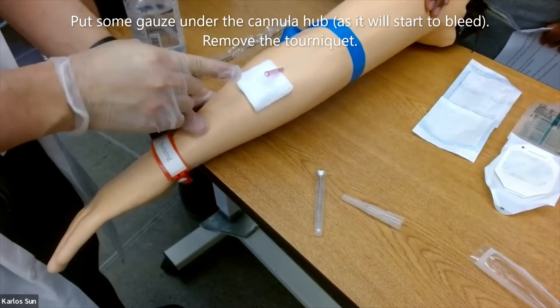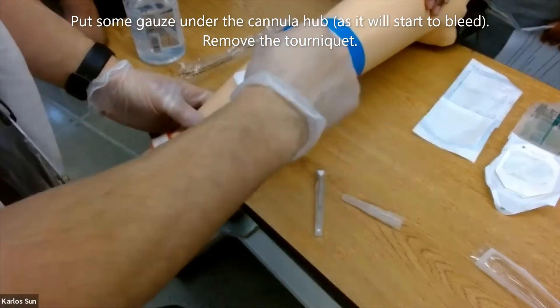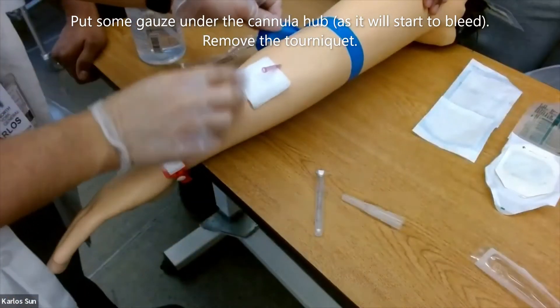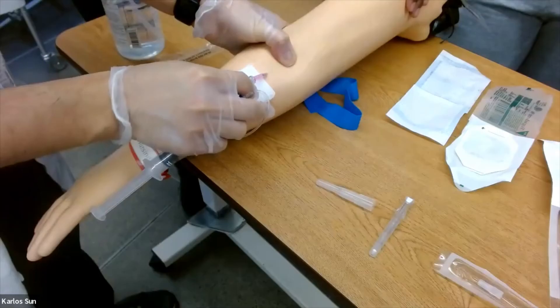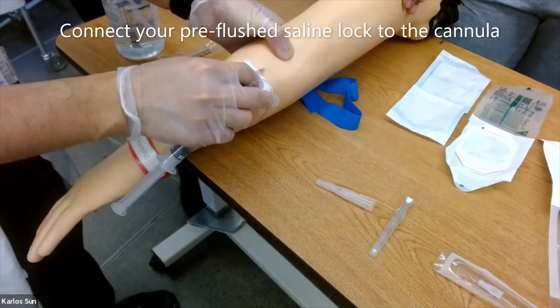Put some gauze under the cannula hub, then release the tourniquet. Connect your pre-flushed saline lock to the cannula.